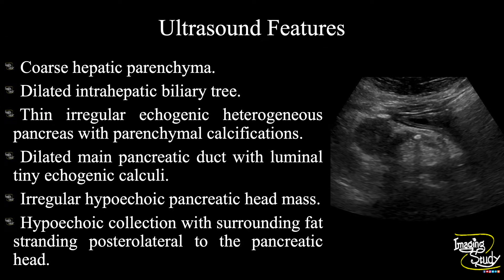In summary: the hepatic parenchymal echotexture is coarse and the intrahepatic biliary tree is dilated. The pancreas is thin and irregular with echogenic heterogeneous parenchyma and multiple tiny echogenic foci indicating parenchymal calcifications. The main pancreatic duct is dilated with at least two hyperechogenic structures casting posterior acoustic shadows within the lumen. There is an irregular hypoechoic mass at the pancreatic head region, and an irregular hypoechoic collection with surrounding fat stranding posterolateral to the pancreatic head. These features suggest chronic liver disease with chronic pancreatitis with ductal calculi, pancreatic head mass, and adjacent inflammatory collection.